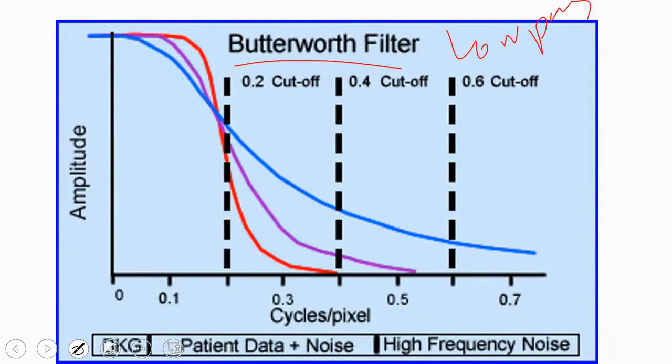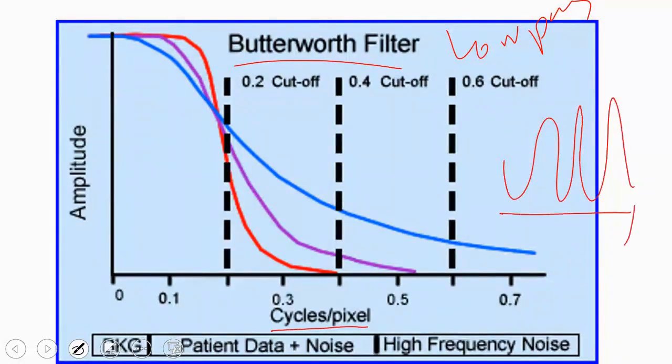Now pay attention, I was saying that my frequency will be given in cycles per second, cycles per pixel. Why? Because the topic of resolution or the signal comes from where and is stored where? In the pixel.